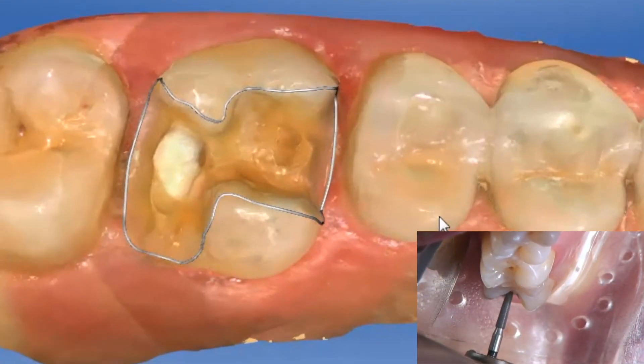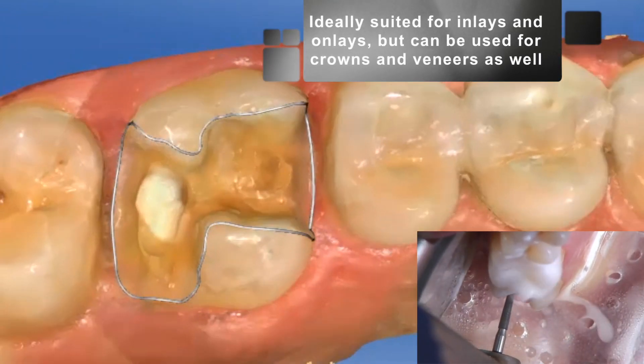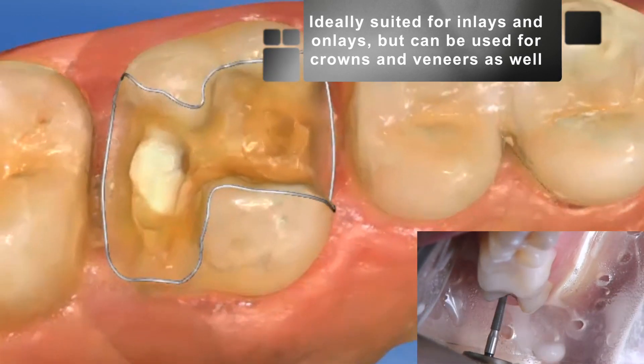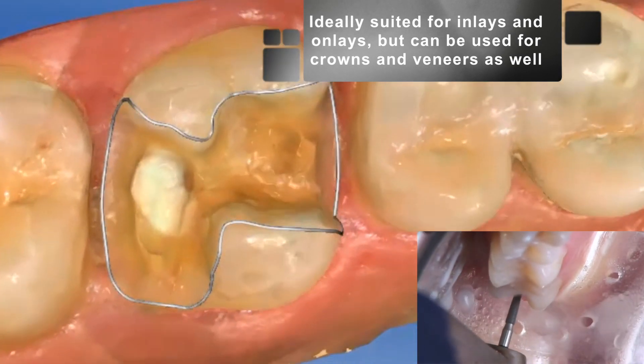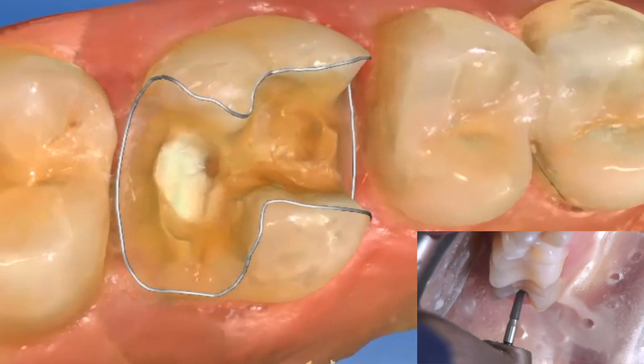Brilliant Krios is indicated for single-tooth restorations both in the anterior and posterior region. While ideally indicated for inlays and onlays, it can be used for all single-tooth restorations including crowns and veneers.